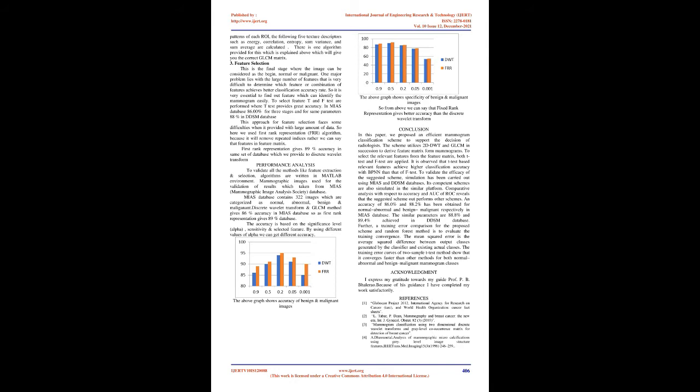A. Region of interest, ROI. The image is composed of different types of noise and artifacts in the background. The object area contains the pectoral muscle. Due to this, the image is not suitable for feature extraction, therefore a cropping operation is performed for the removal of noise. This operation is performed by considering the center of area. The result of this operation gives you an image which is noise-free.